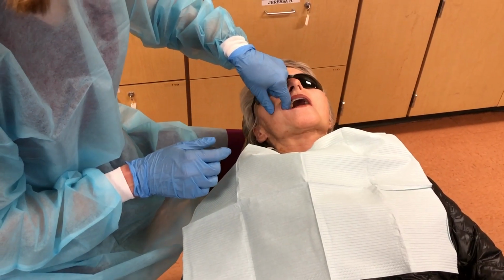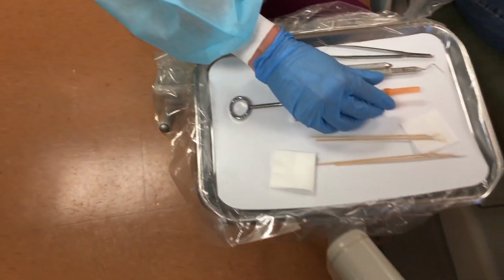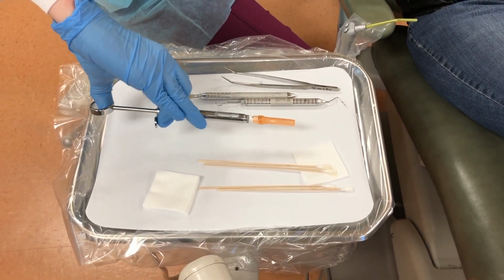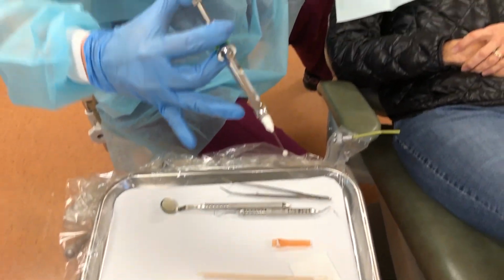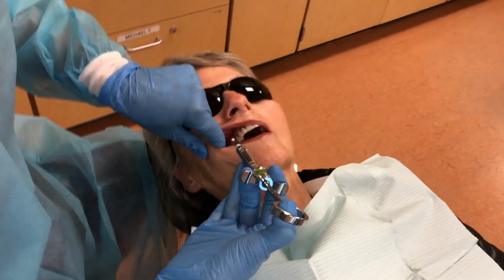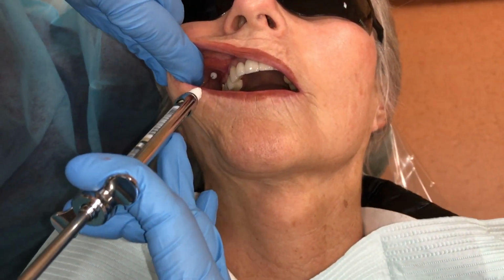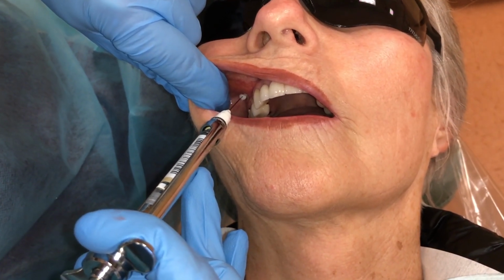Retraction will again include the index finger and the thumb, stabilizing the cheek outward and upward. The clinician will loosen the cap with one hand, provide stability with their ring finger, carefully approach the patient, and identify the penetration location above the maxillary second premolar.